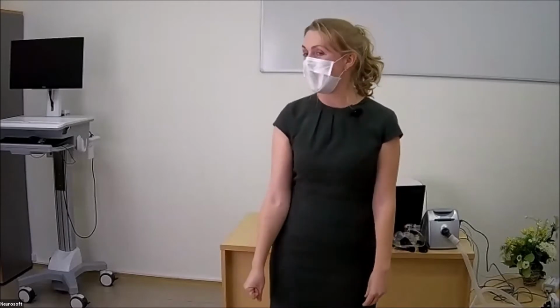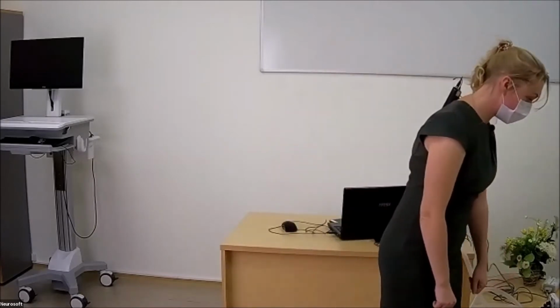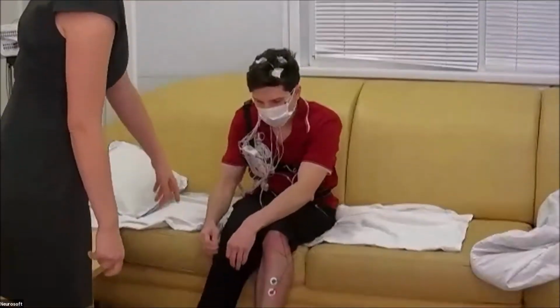Oh, sorry, I forgot about EMG electrodes. And please sit. So we need two bipolar EMG electrodes, which we put on the patient's leg. So we try to show you. With one channel, this is another channel.